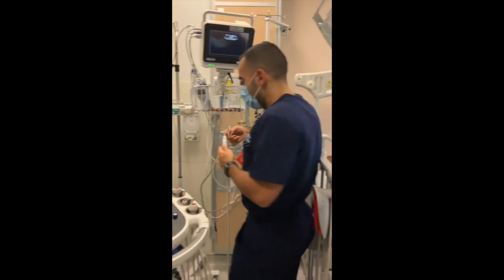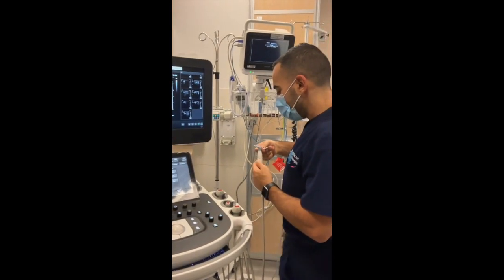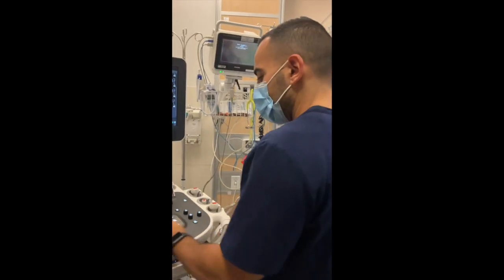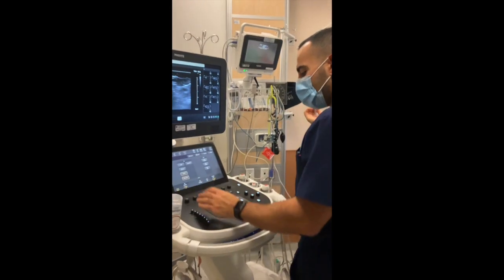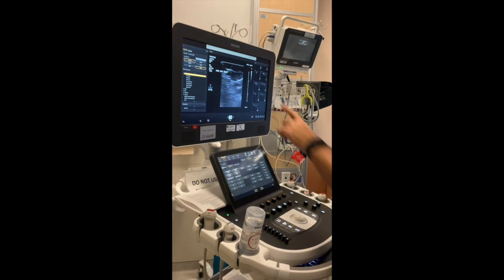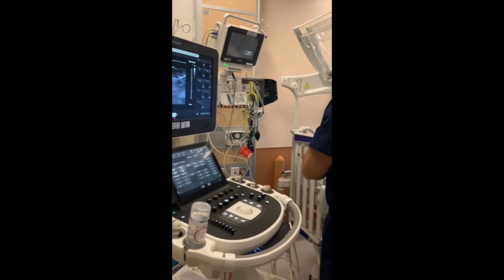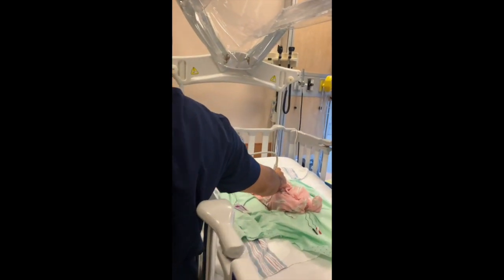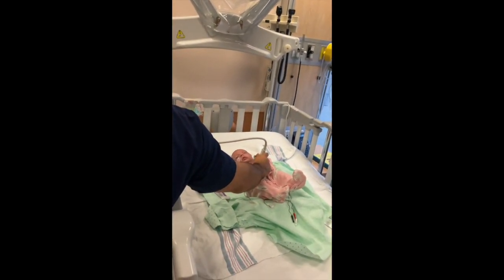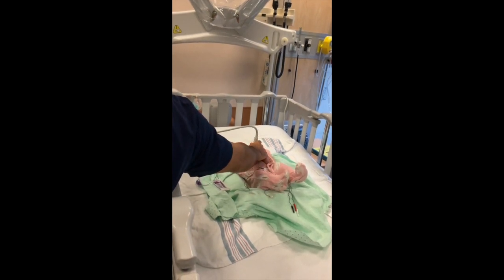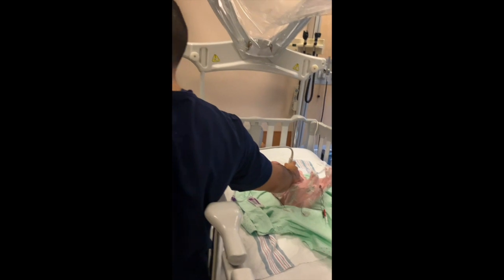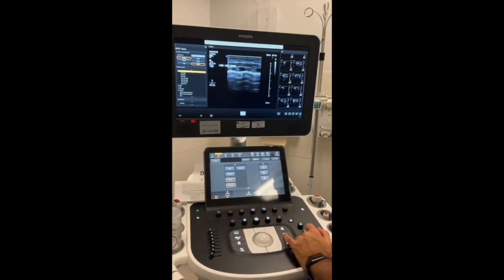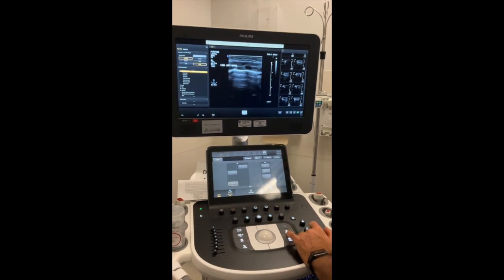We can do the same thing on the left, but for the project the initial scans will only be on the contralateral side of the hernia. I'm going to go into my labels, select the left lung upper lobe, mid-clavicular. As I slide from the clavicular area to the nipple line, I acquire. I can redo another sweep — I see my ribs, I see my A-lines, and I slide down until I get to about the nipple line.